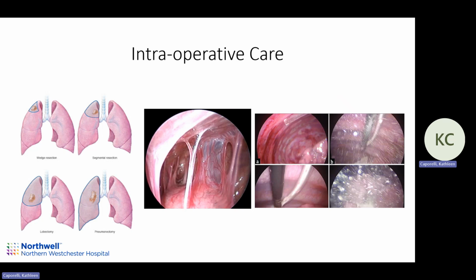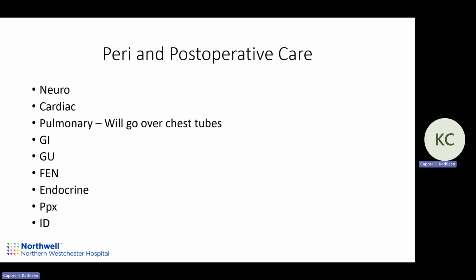And even if they do pop the lung a little bit more, at some point the lung is so stuck up against the chest wall that it'll be a very small, loculated pneumothorax that you don't need to worry about. It's not usually life-threatening. Does that make sense? Any questions? Okay. I'm sure you guys are probably all taking care of one or two varieties of these patients.